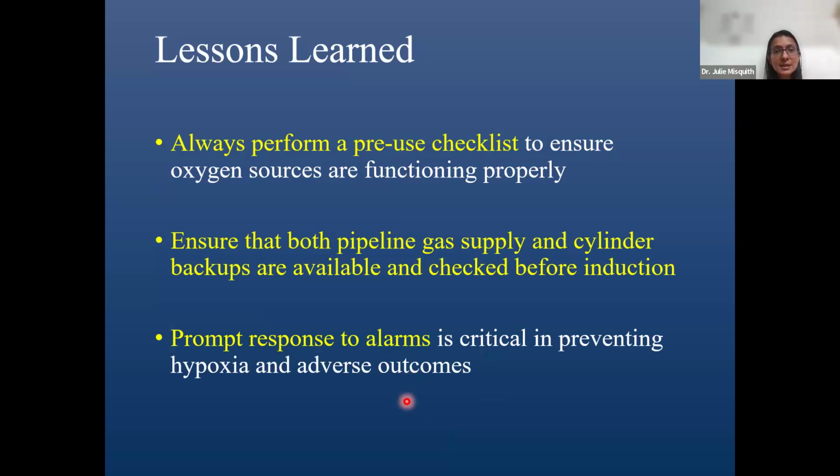There are many times we disable alarms, but many of the newer machines have the option that after 3 disabled alarms, the alarm will be a high alert alarm. This is a safety feature which is provided by the newer workstations.